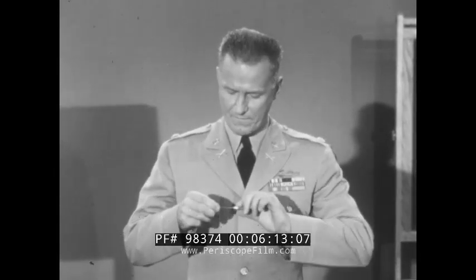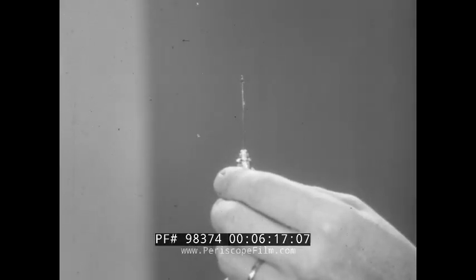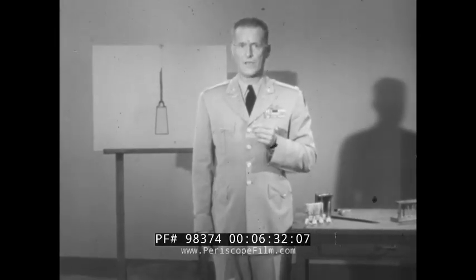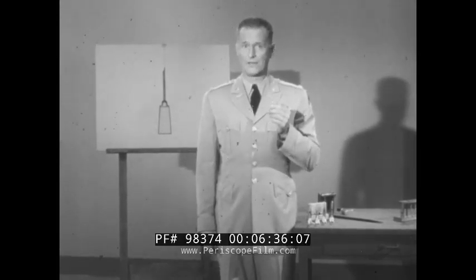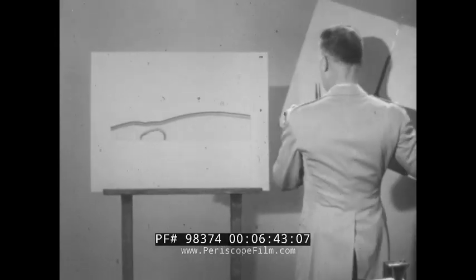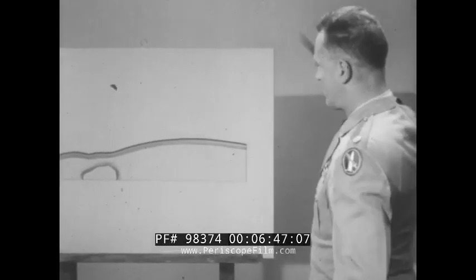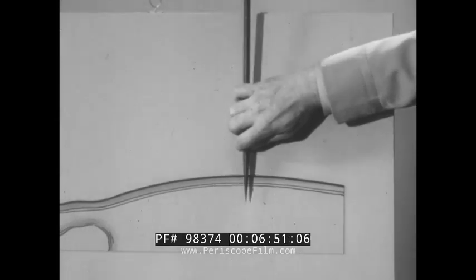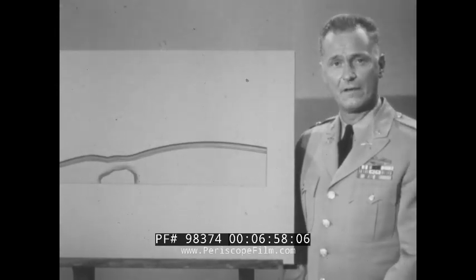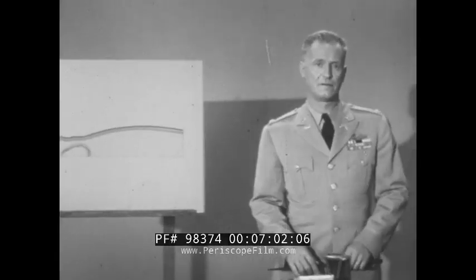Now I shall open a real syrette and prepare to use it. I shall repeat the procedure I have just described. Now I know it's open, I can discard the stylet. Stick the needle straight into any convenient muscle. The easiest place is the side of your thigh — that is where I would inject it if I really needed a dose of atropine. Stick the needle straight in and all the way in. Simply squeeze the tube until empty and you have the dose of medicine you need. There is really not much to it.